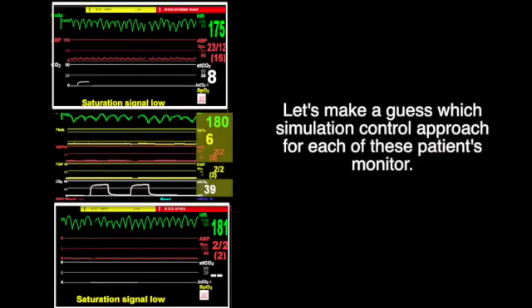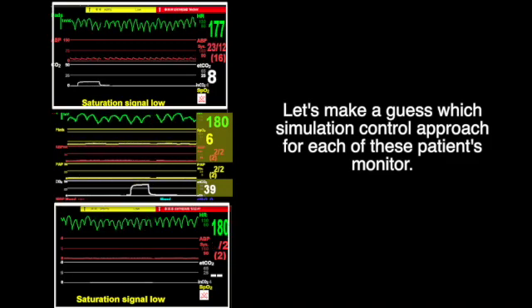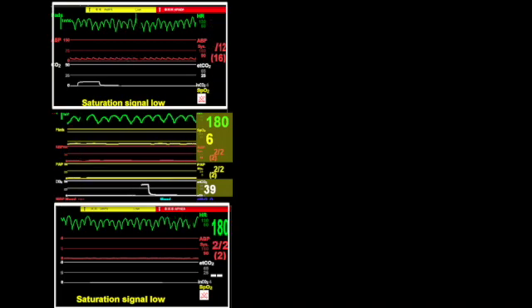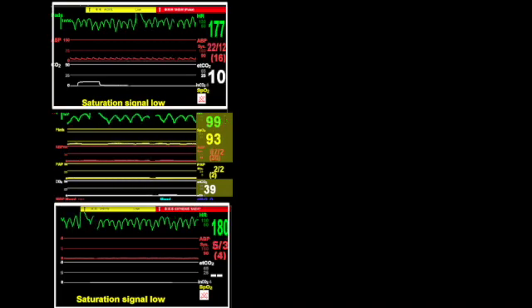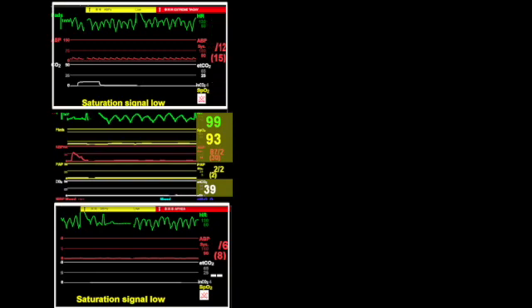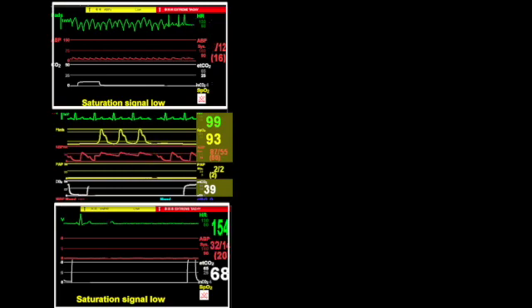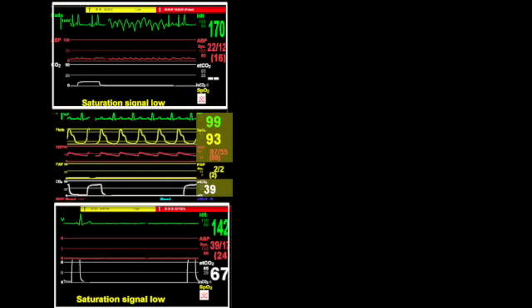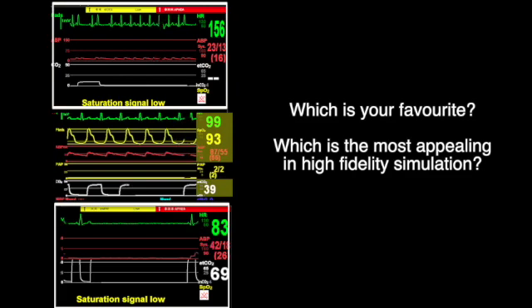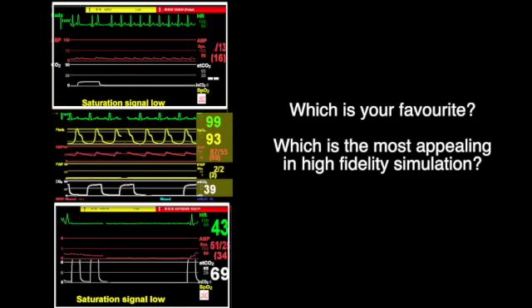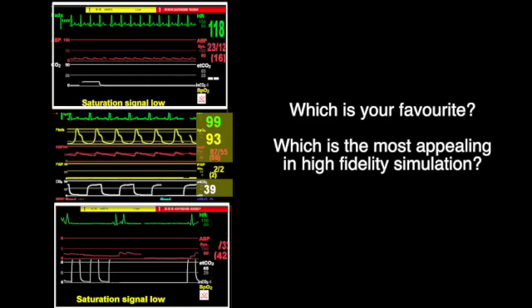Let's make a guess about which simulation control approach is used for each of these patient monitors. Which is your favourite? Which is the most appealing in high-fidelity simulation?